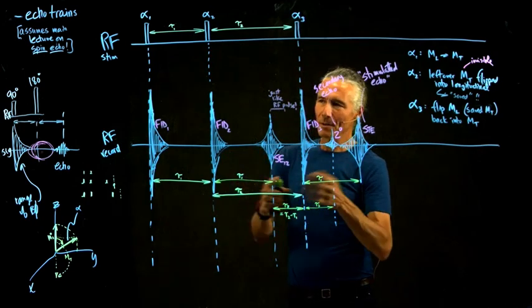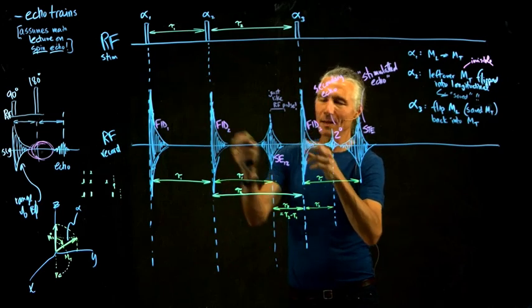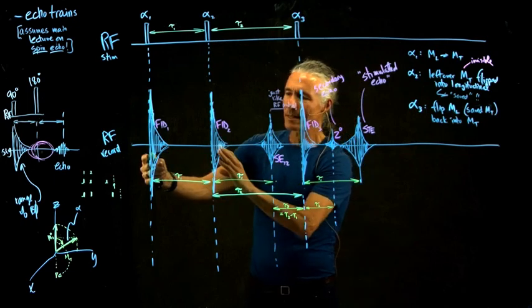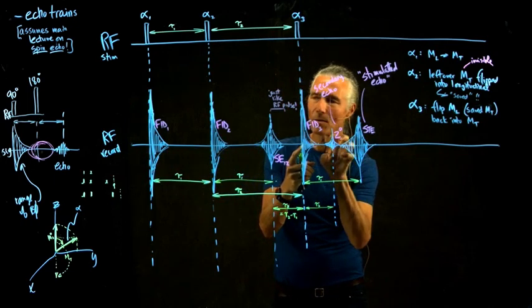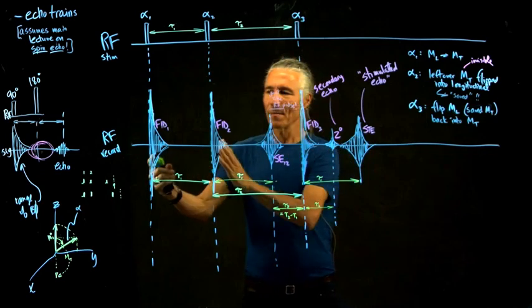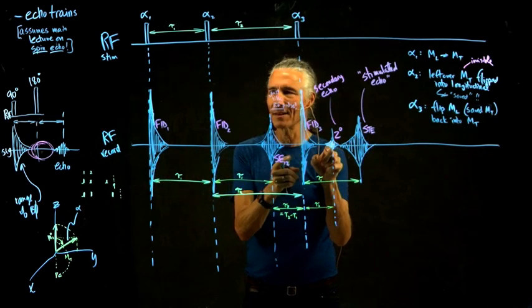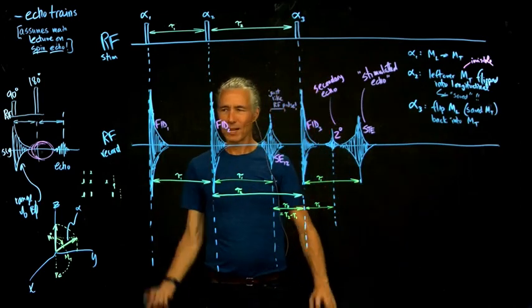So this was figured out just with little chemical samples, just adjusting the time between the FIDs, and you can clearly see, if I just make this time a little shorter, this stimulated echo would just come in a little closer. And they could easily be on top of some other echo. Like, if I made this a little shorter, that will sort of pull this guy on top of the secondary echo. So you might have a secondary echo on top of a stimulated echo. That could easily occur.